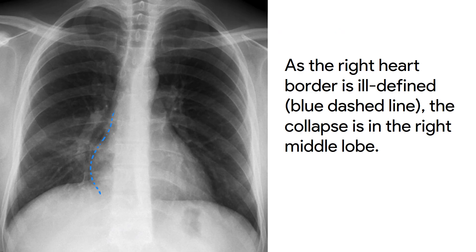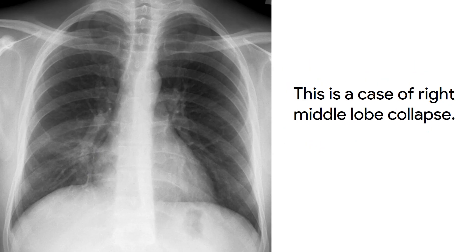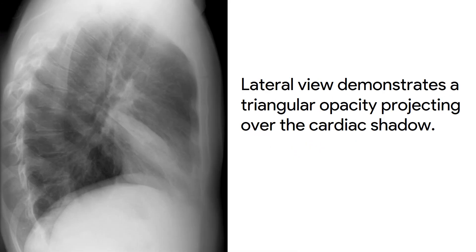As the right heart border is ill-defined, the collapse is in the right middle lobe. This is a case of right middle lobe collapse. The lateral view demonstrates a triangular opacity projecting over the cardiac shadow.